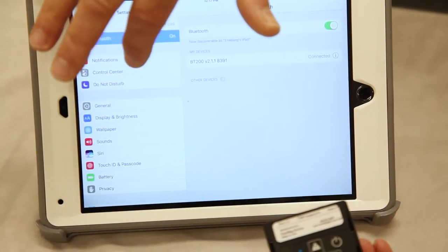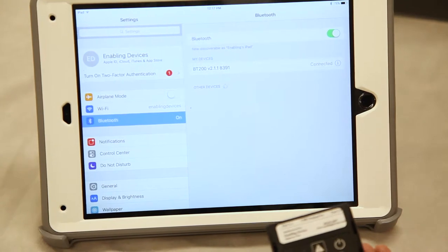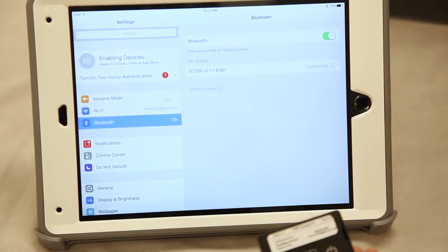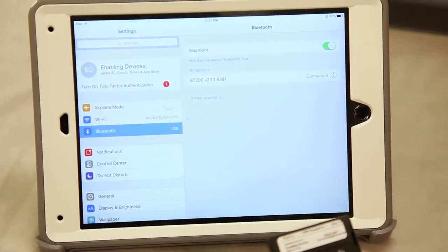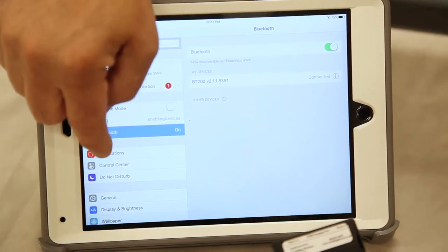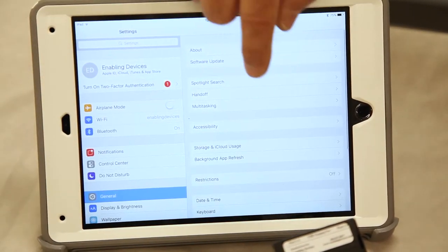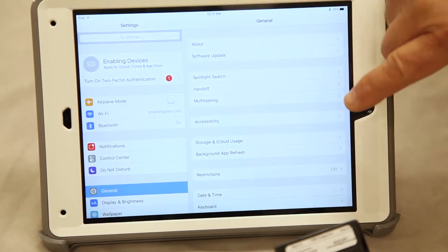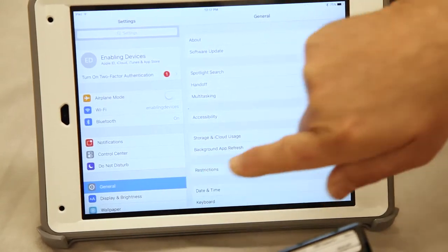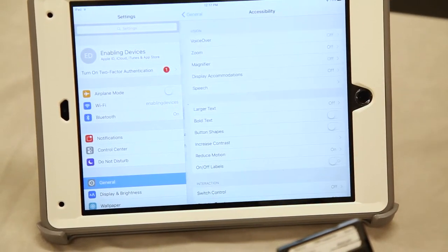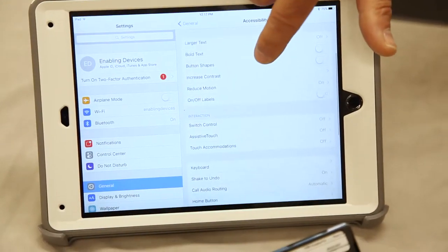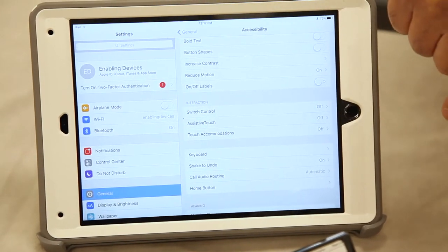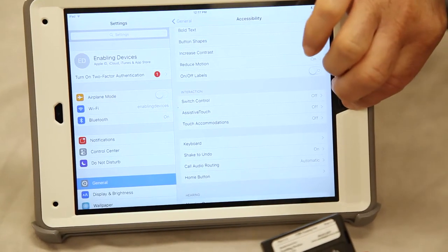One other note is there is assistive technology mode on the iPad. When you're using switch friendly apps, you want to make sure that switch control is turned off. So that goes under General, under Accessibility. Just want to make sure that switch control is turned off, which it is. And then you can get out of here.